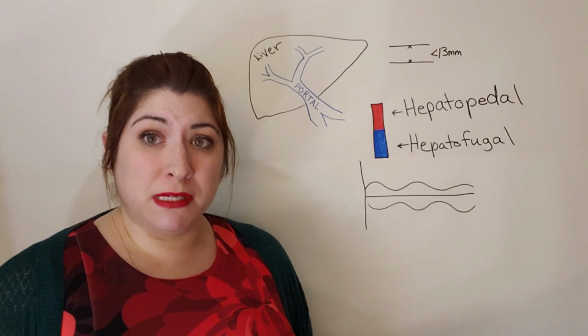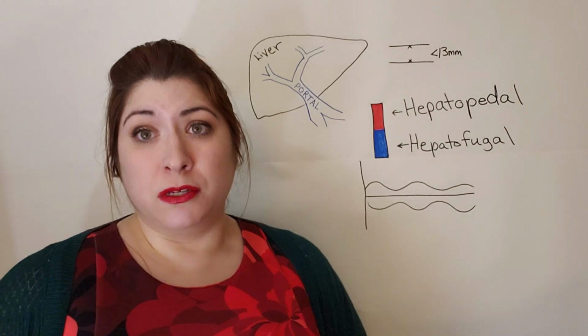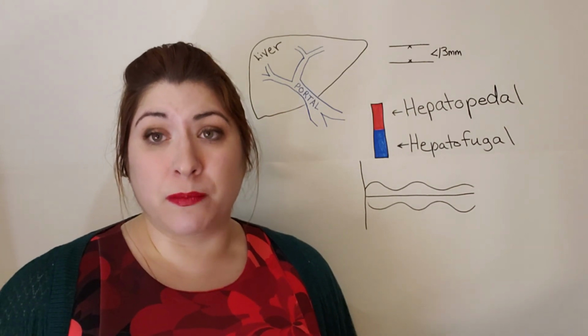So that pretty much sums it up. As always, with everything with ultrasound, it's very operator dependent. So you want to make sure that you're vigilant and using the proper techniques.